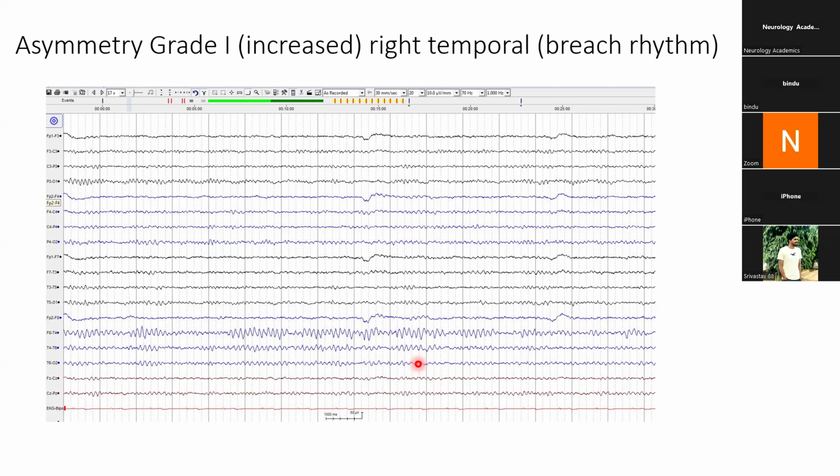the answer that it's asymmetry. But if you see that no surgery has been done, then it is for the technologist, especially if they are in the lab, to palpate that area and see whether there is a fall or a trauma or something which has caused a skull defect in that area. And then there are certain congenital syndromes in neurology where the skull defect is part and parcel of the syndrome. So these are the common instances in which there can be an asymmetry.